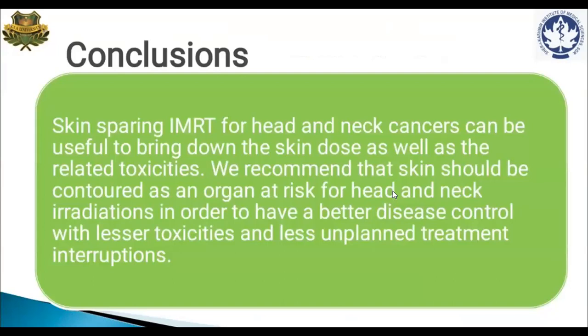Conclusions. Skin sparing IMRT for head and neck cancers can be useful to bring down the skin doses as well as the related toxicities. We recommend that skin should be contoured as an organ at risk for head and neck irradiations in order to have a better disease control with lesser toxicities and less unplanned treatment interruptions.